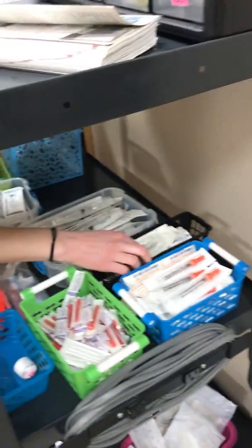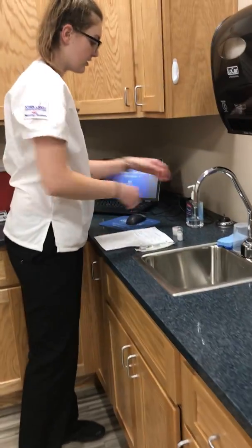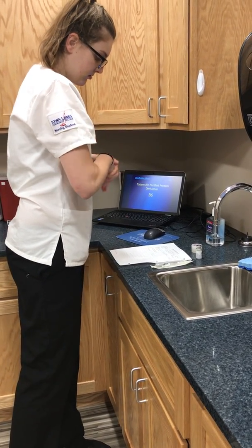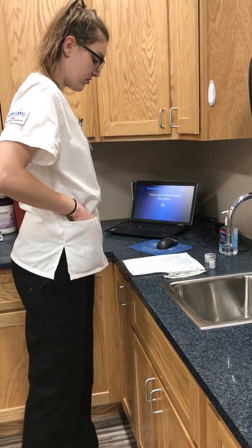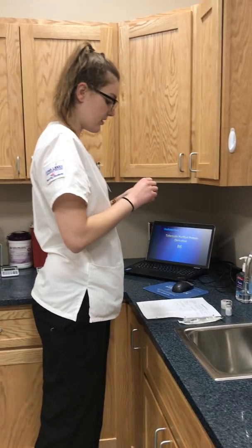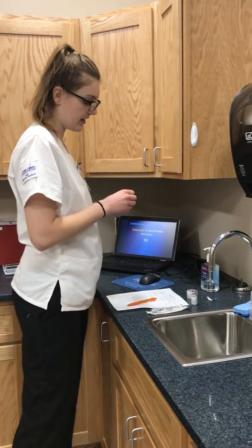Okay, so I also need to grab a syringe. See that I scrub the hub for 10 seconds.